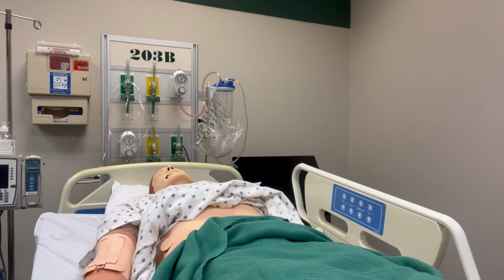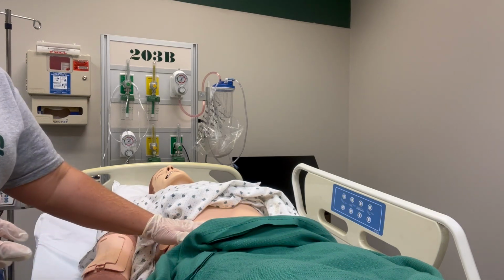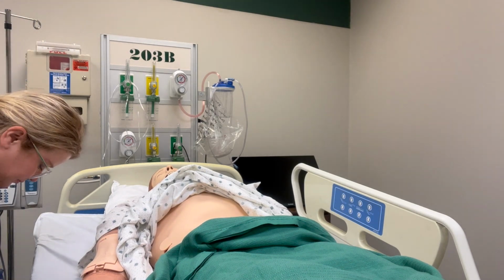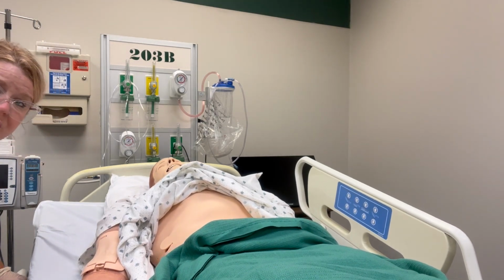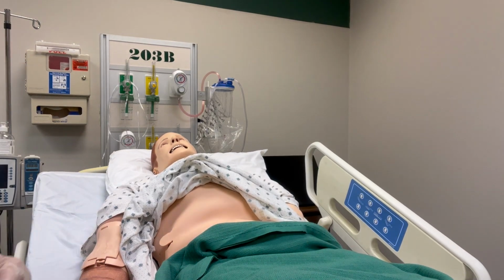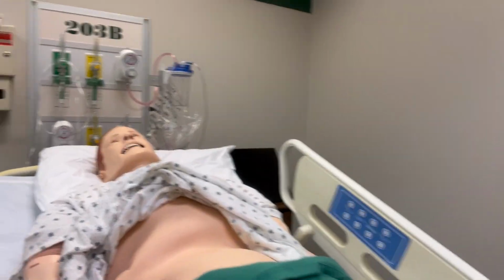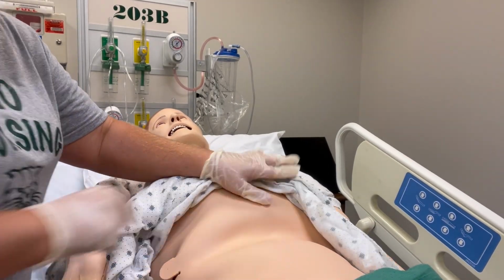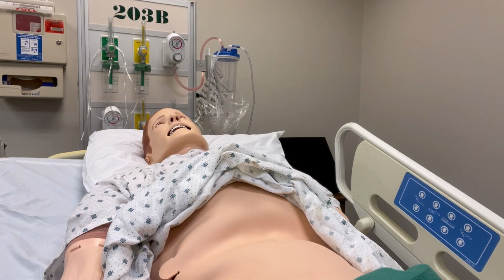So I'm going to go ahead and I'm going to clean. I don't want to go too close to his belly button, so I'm going to do about 1 inch from his belly button. So you guys can come a little closer if you want so you can see better. So you can see his little belly button there. Yes, Mr. Smith. All right.